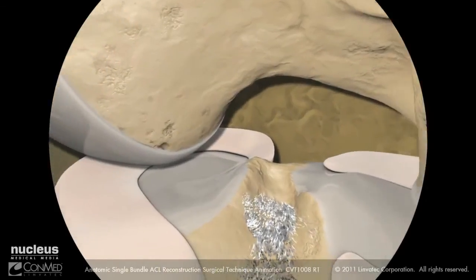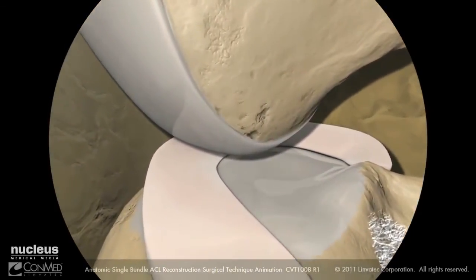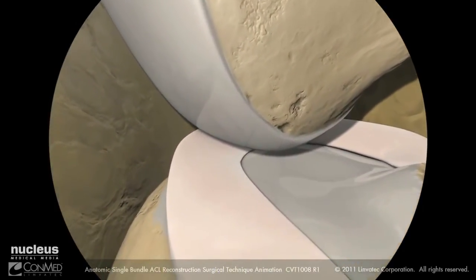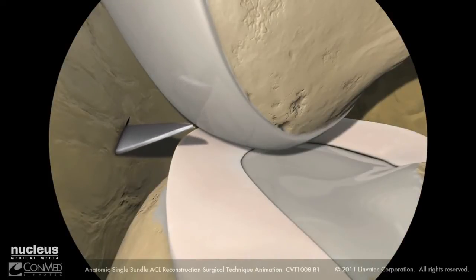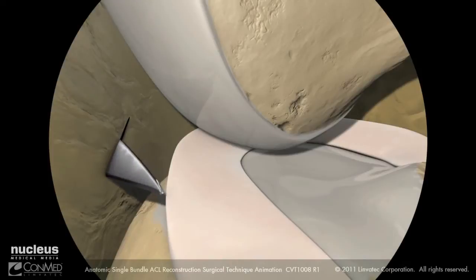Using an 11 blade, incise the skin, making sure to orient the blade away from the femoral condyle to prevent damaging the articular surface.